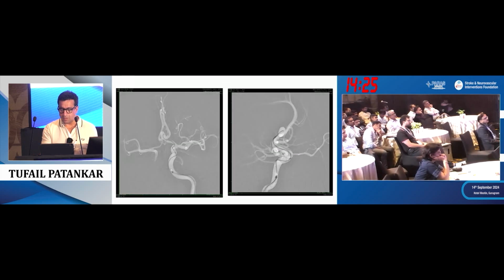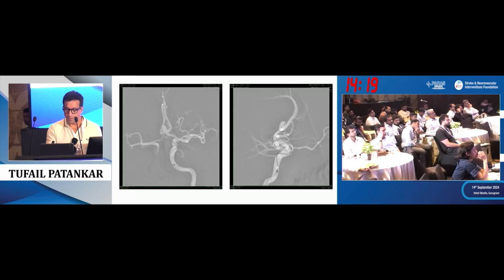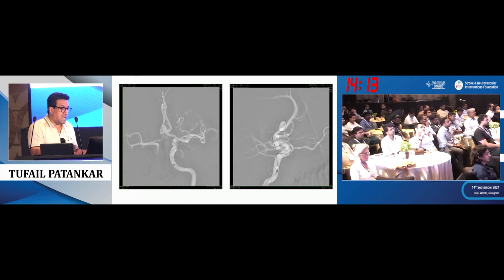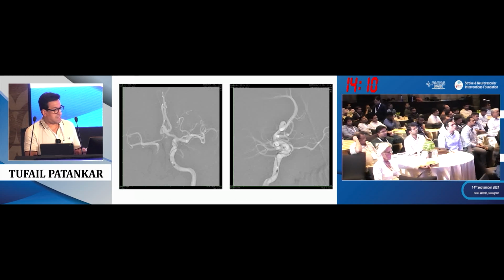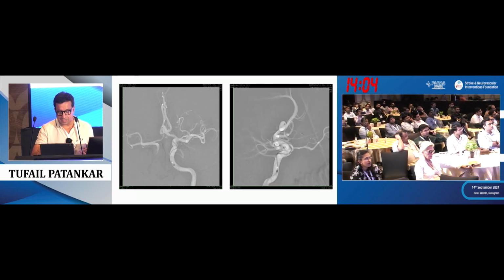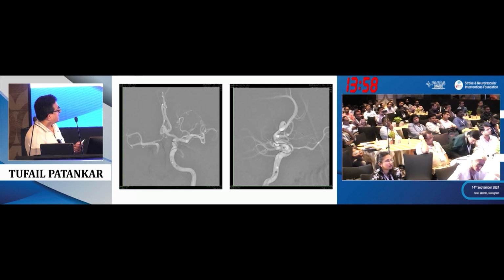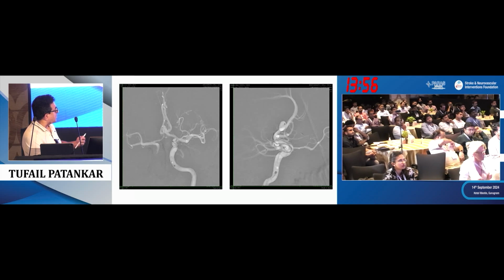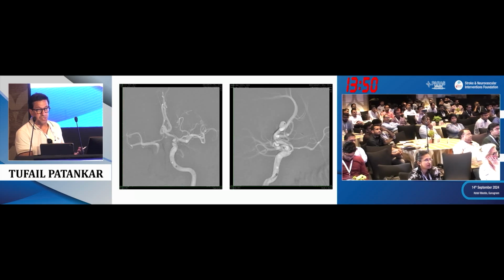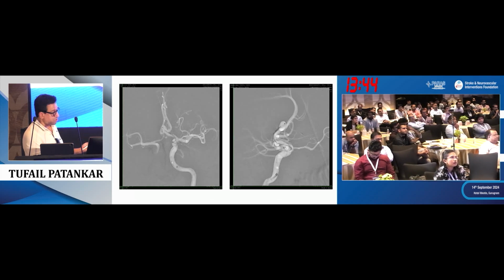So if you look at it here now, let's move to the next where I can get the device in. So you catheterize like usual, get your position. Here you can see the catheter is a bit higher, which is good because you can then decide whether you want to push or whether you want to unsheath. So again, here when you got quite a good access, you can pretty much get the device a little bit more comfortably in. As you can see, the device is getting in, and as you take a little bit of time, I always use a distal triaxial system. I don't use Benchmark. I think when you get into trouble, it's not easy. So don't hesitate to use a triaxial system.